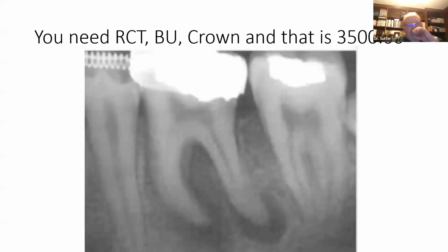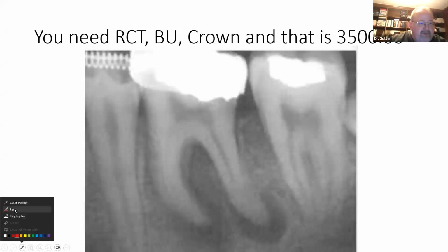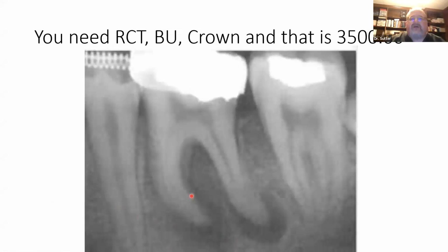Okay, so you need to treat your T-scan and your T-scan data as you would your x-rays and your intraoral camera. So when you see this in the patient's mouth, it's easy, right? Because you can show the patient, oh, look at the, let me just grab my laser pointer here. You say, yeah, look, Mrs. Jones, you got this abscess going on here. And they're like, well, you know, I don't feel any pain. Can I put it off? No, this is an abscess infection, and you got to take care of it. Otherwise, you know, it gets worse and it can involve other teeth.